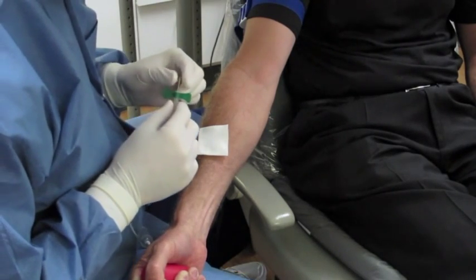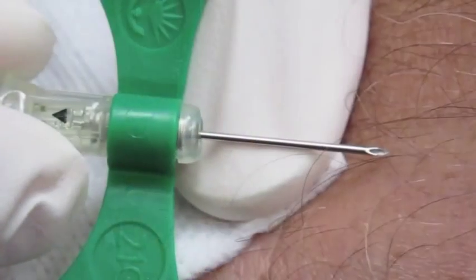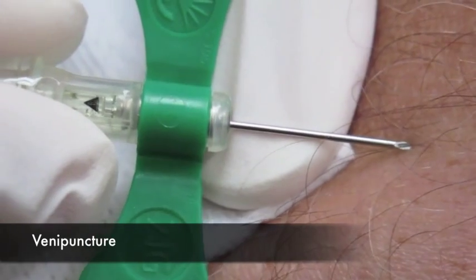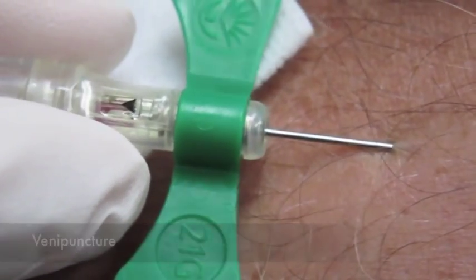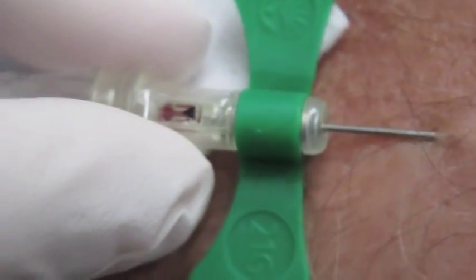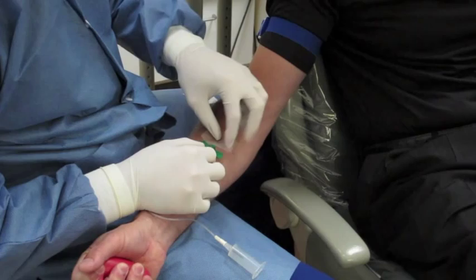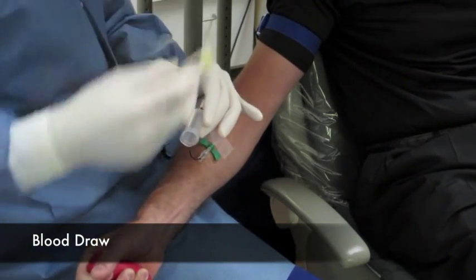We use the butterfly needle very often because it's easier for blood draw, particularly for a beginner. It has a nice little flash component that you can see when you place it into the vein — you see the flash that comes in. Then you can tape that down or hold it steady as your assistant draws the blood. We tape it down here so it doesn't move and stays secure.